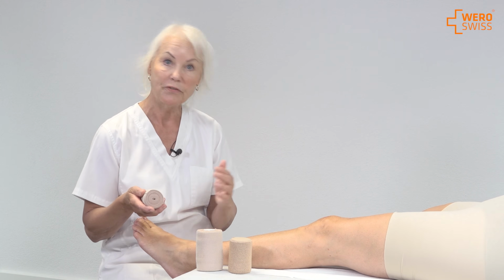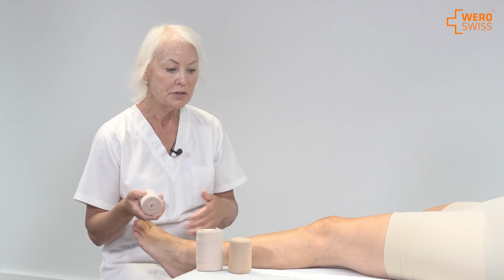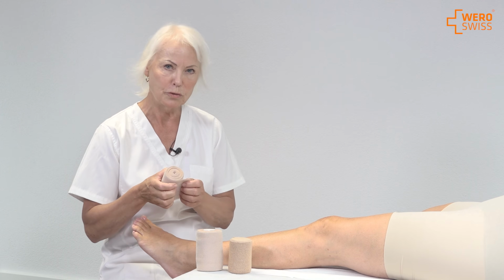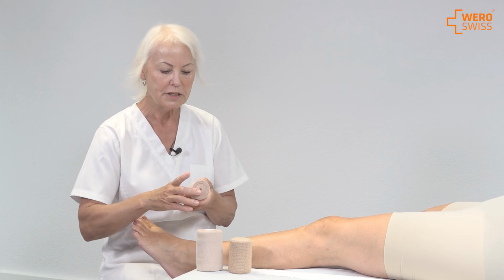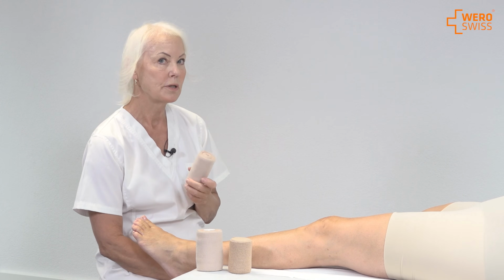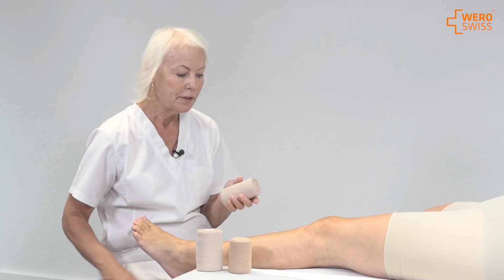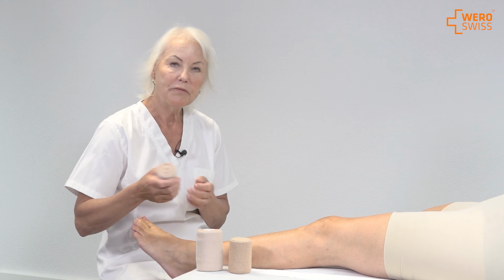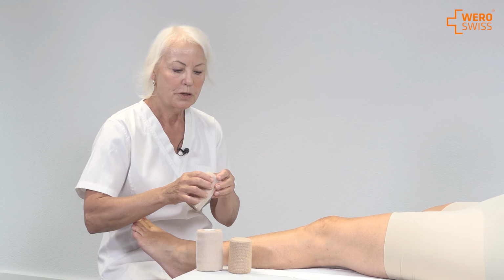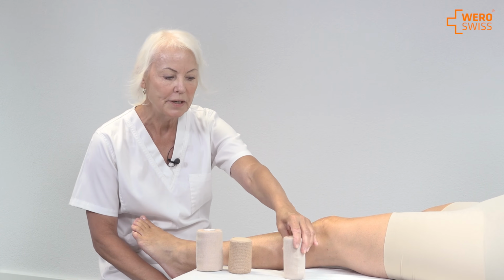You reach the fascia and you reach the muscles. Also, lymphedema patients tend to have a lot of subcutaneous fat that needs a good strength from the low elastic bandage. This is mainly to be used for patients who are up and walking and doing exercises, because they have a very high pressure when moving. The pressure when resting is very low in this bandage.